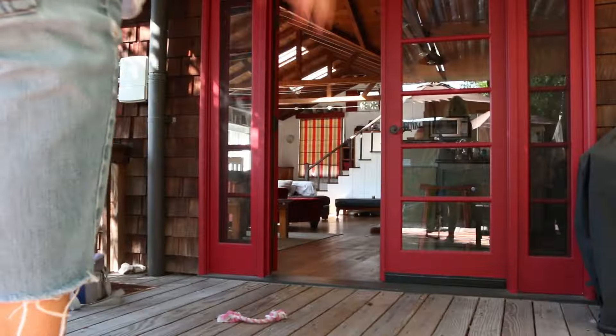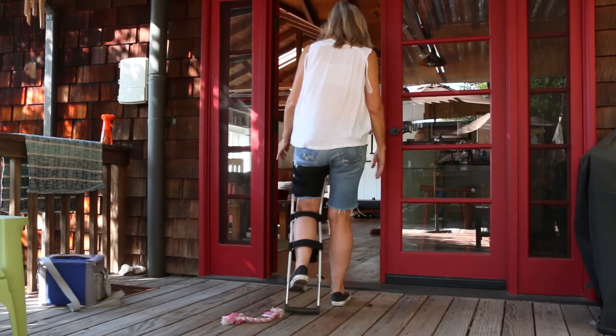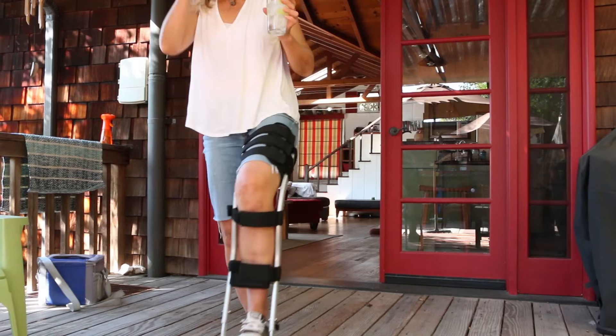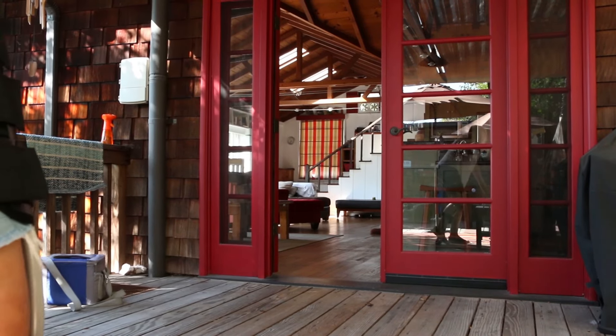Okay, here we go for a little walk — maybe not the best idea holding the camera. I can carry a glass with this thing! Okay, that might sound silly, but when you're on crutches you can't carry anything.